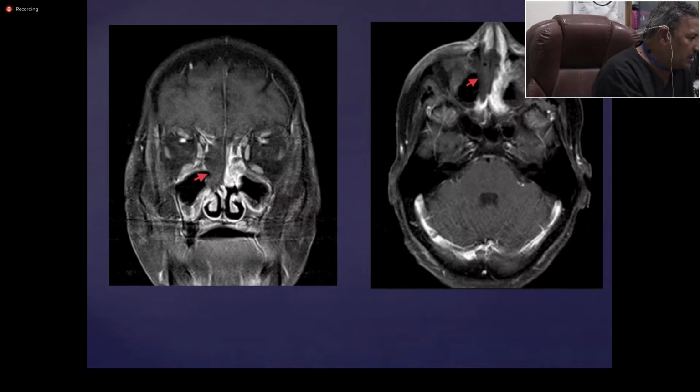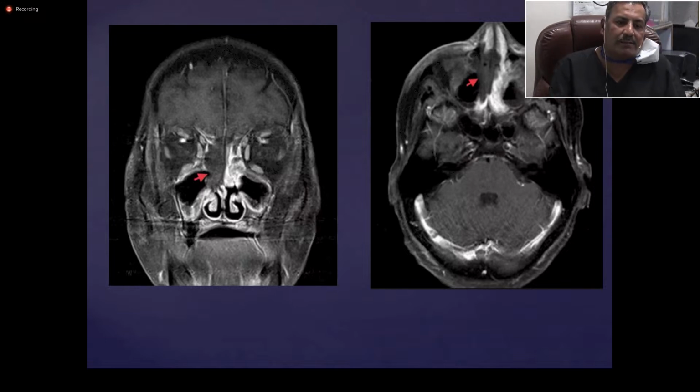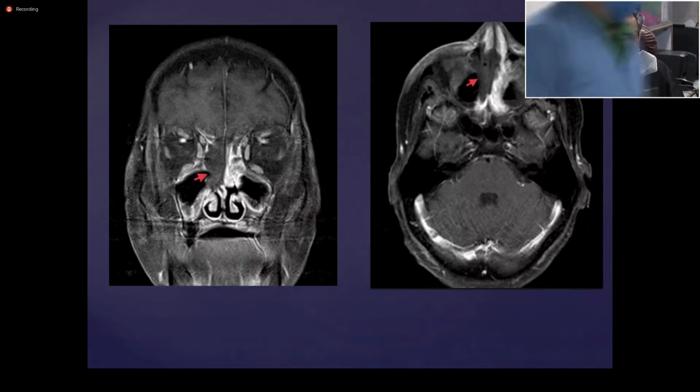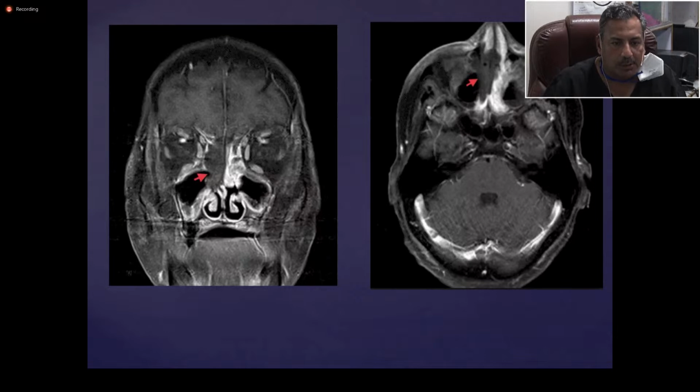See this in the next picture on the right side. See this, all enhancing areas need not be debrided. Enhancing means your gadolinium is reaching. You don't need to unnecessarily resect and give morbidity. Only those areas need to be debrided where the gadolinium is not reaching and giving dark areas. Lack of contrast enhancement is the key to guide the surgical resection.